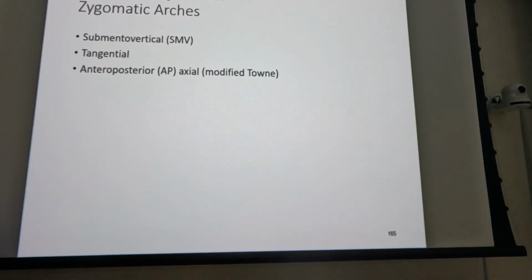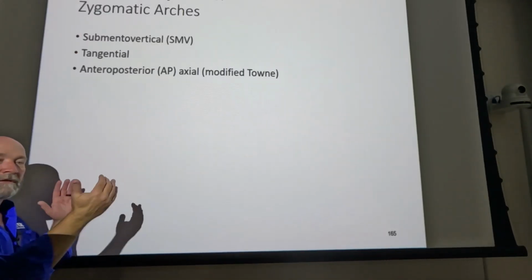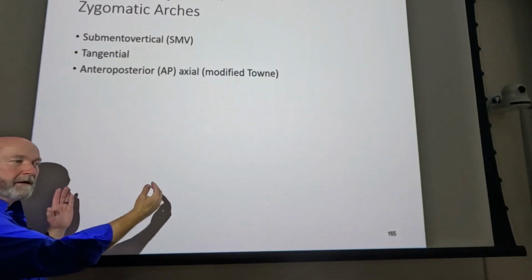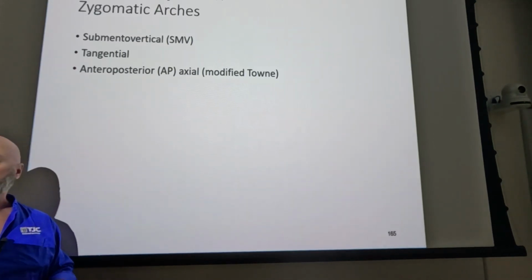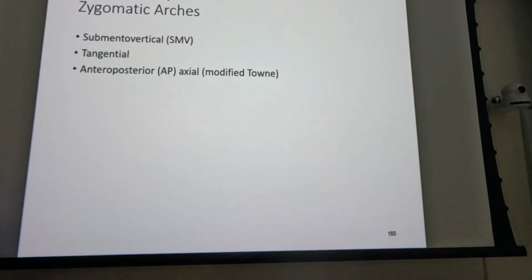You get magnification, but what else? Less sharpness. But how might it benefit you? What's greater at lower SIDs when you decrease your SID to cover the same amount of image receptor? What do you have to do? You have to open your collimation.